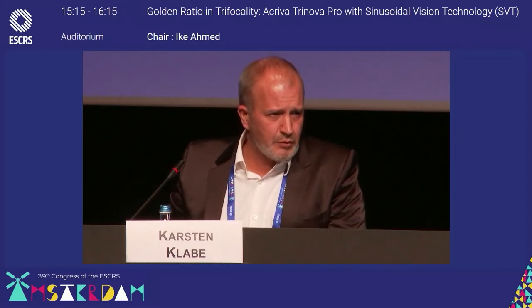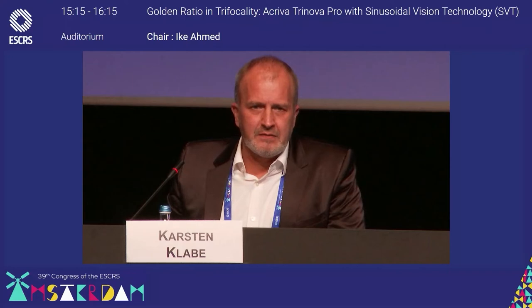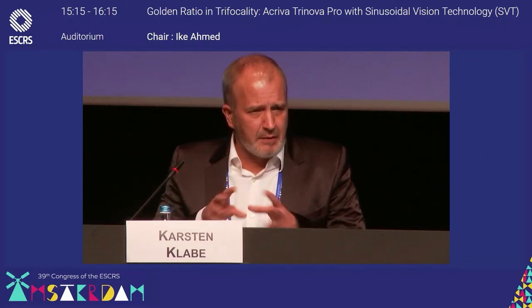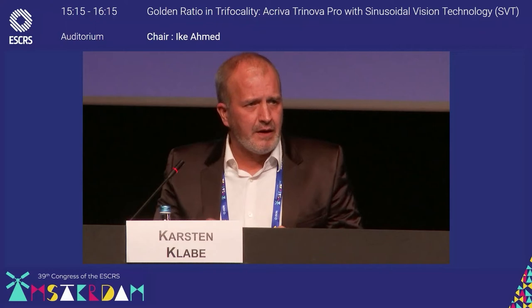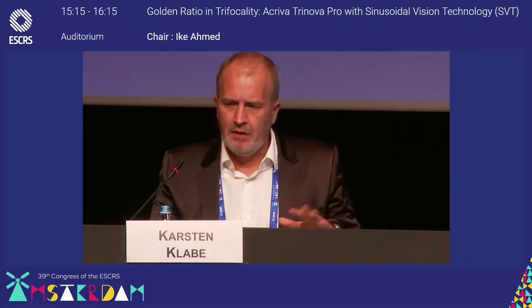The first lenses I put in the shooter, otherwise my nurse will do this during the procedure, so I'm not in trouble with this. But the delivery of the lens is independent of the plate haptic or the C-loop haptic. It's really easy. It snaps open a little bit faster than a typical hydrophobic lens, as you've seen, but it's fine.